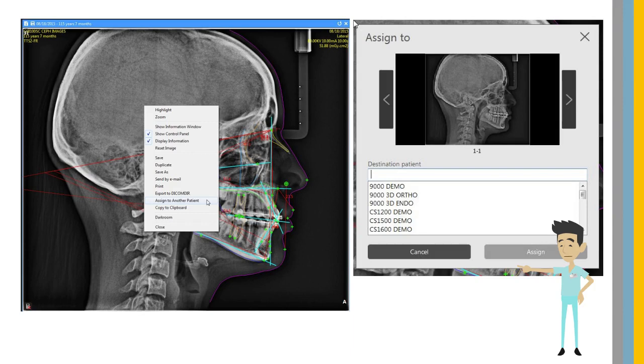If you acquire or import an image into the wrong patient file, using just a couple of clicks, you can assign the image to another patient.